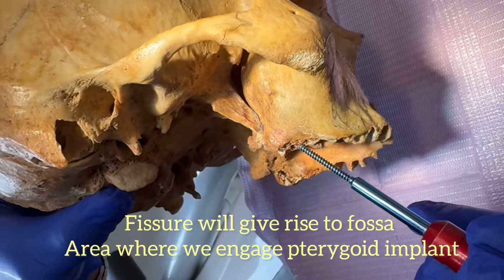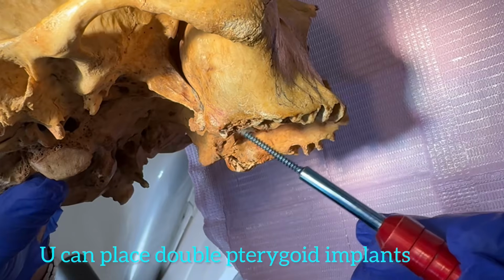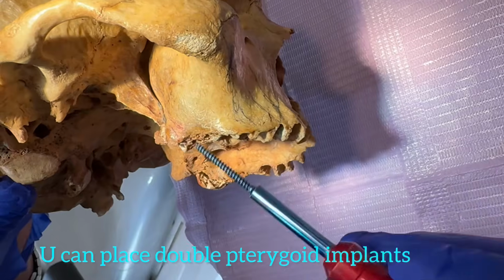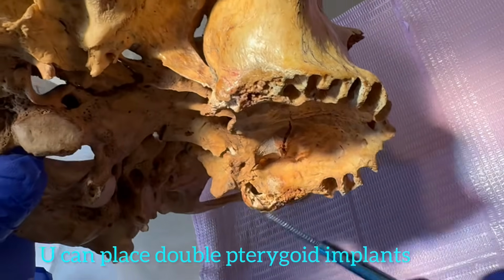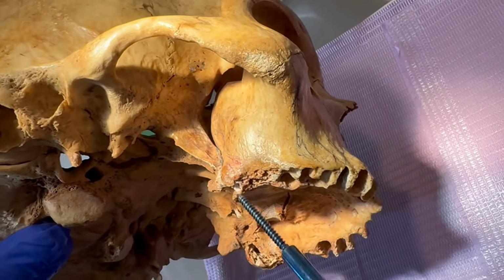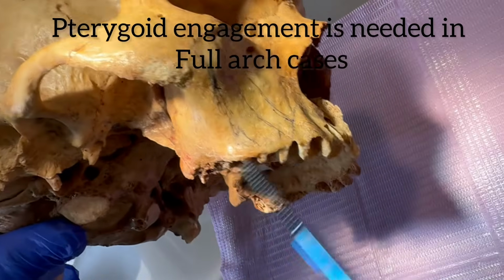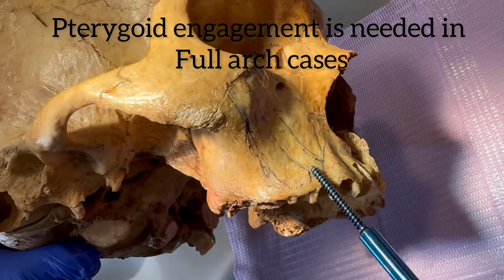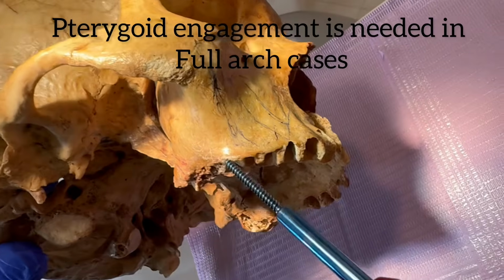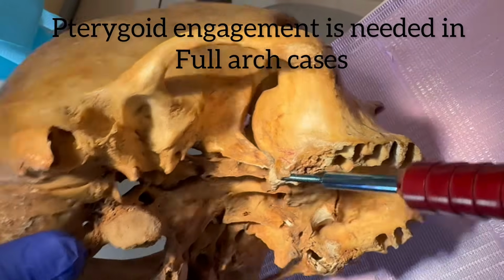Whenever you are placing the pterygoid implant, you can place one pterygoid or otherwise double pterygoid, single pterygoid or the double pterygoid. If you have enough space in the bone, you can place double pterygoid, or otherwise you can place single pterygoid on either side. The purpose of placing pterygoid implant is to avoid the cantilever effect in full arch cases, and also to avoid any other procedures related to the maxillary sinus. You can avoid all those procedures, that is sinus lift and augmentation procedures. So directly you can place your implant in the posterior part, that is the terminal end of the bone.